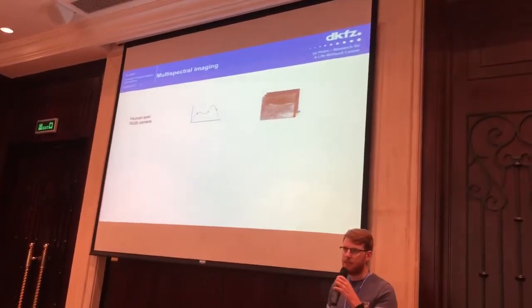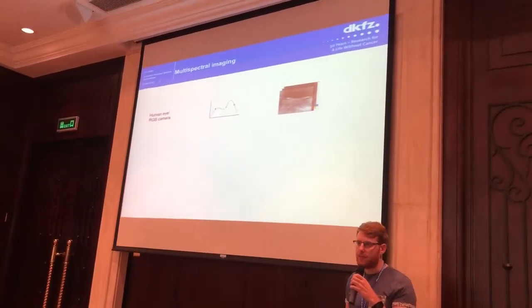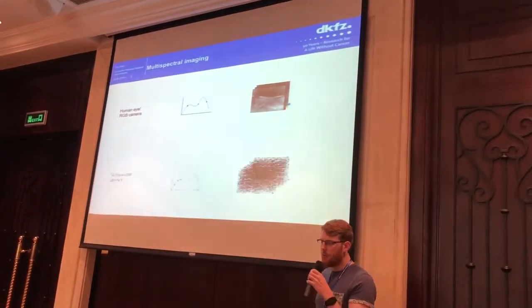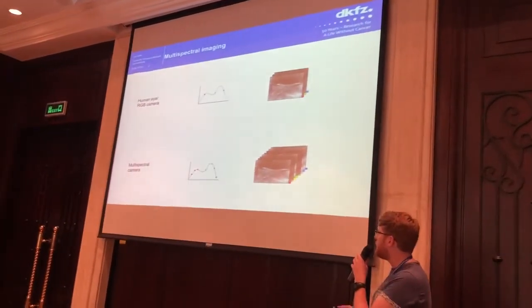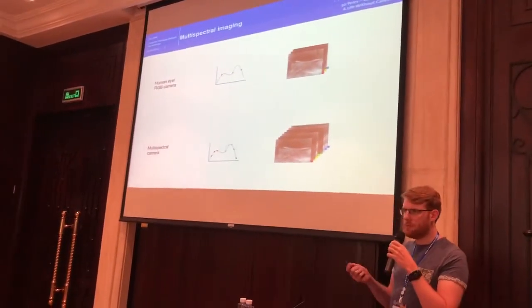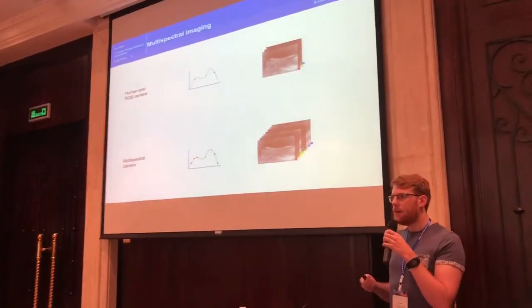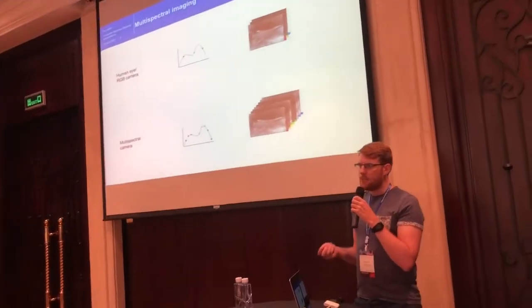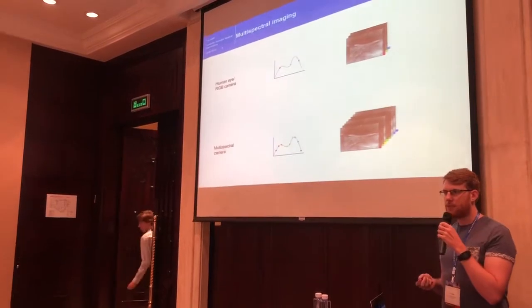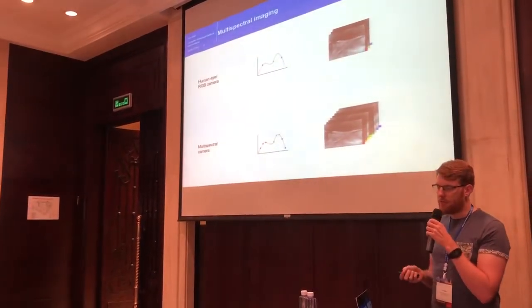We can only see basically 3 colors and make up all the rest. And we said, okay, we probably need more information than that to answer this. And that's where multispectral imaging came into this problem, into our journey. So instead of just working with 3 colors, red, green, and blue, we use 8 or even 16 bands of colors to get more information of the spectra. And then maybe use that information in the spectra to regress interesting tissue properties, and then predict the perfusion of that organ.